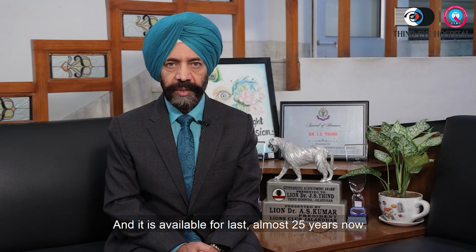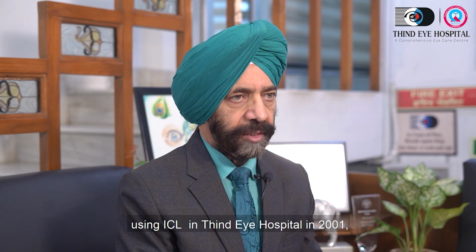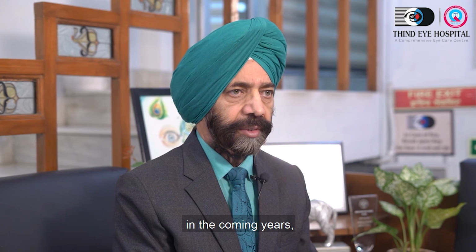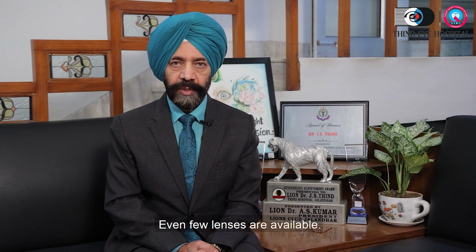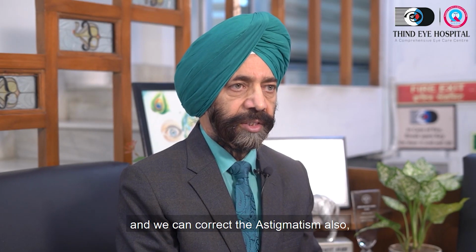Lens-based procedure is really good and it has been around for almost 25 years now. We started using ICL in Thind Eye Hospital in 2001 and we were the first to introduce ICL in India. To begin with, ICL was just a spherical ICL. Then in the coming years, Toric ICL came in, where we can correct the astigmatism. Advantage of ICL is that it can correct the power up to -20. Even a few lenses are available where we can go beyond that power also, and we can correct the astigmatism also.